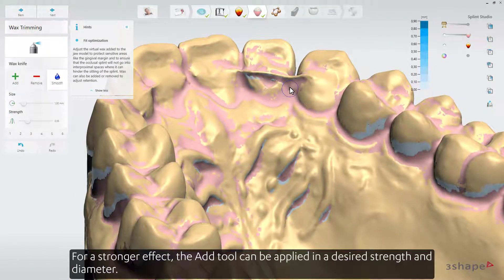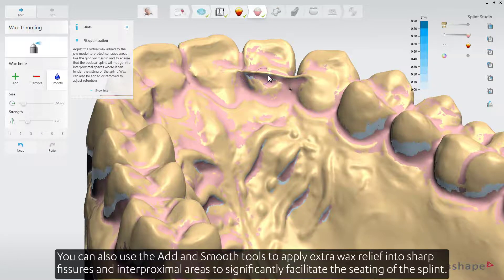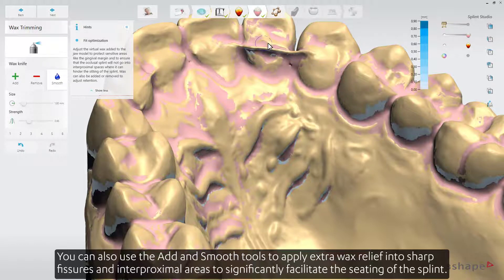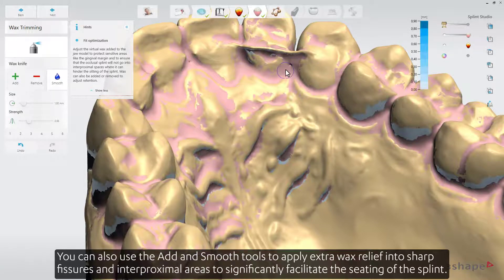For a stronger effect, the Add tool can be applied in a desired strength and diameter. You can also use the Add and Smooth tools to apply extra wax relief into sharp fissures and into proximal areas to significantly facilitate the seating of the splint.